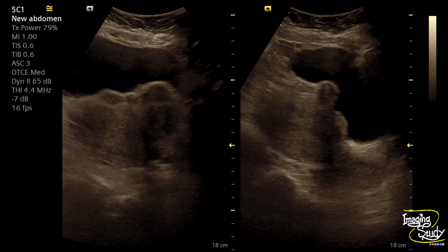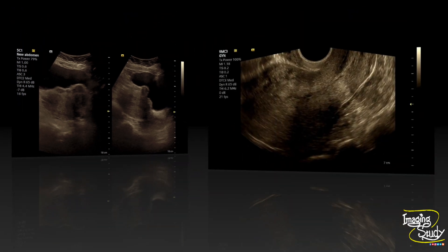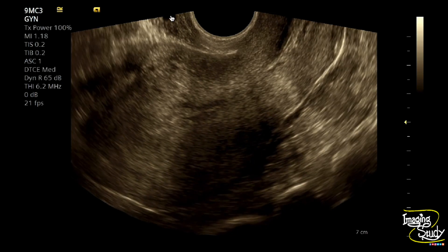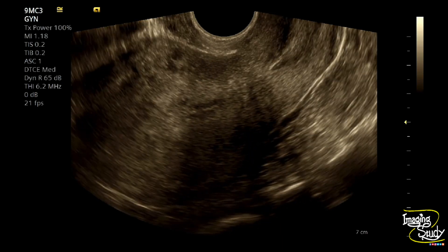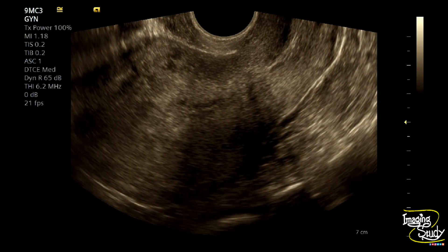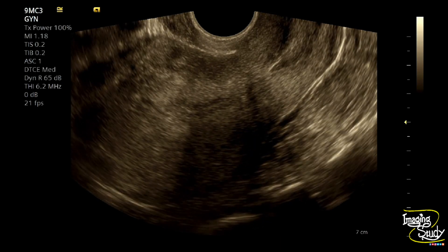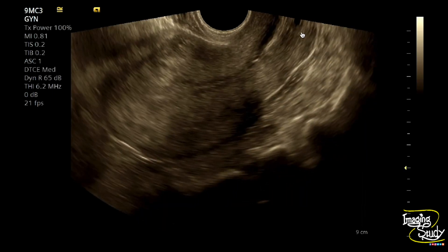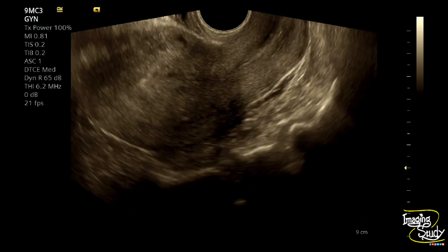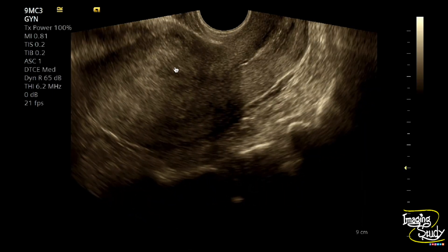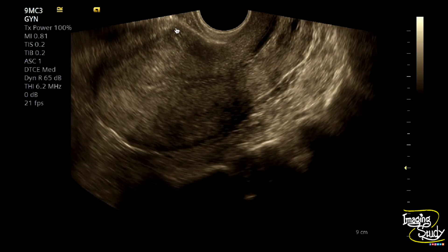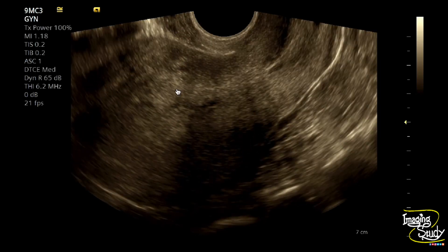Now let's go for the transvaginal ultrasound findings in this patient. Here's the longitudinal section of the uterus — the uterus looks slightly bulky. If you look carefully, there is something within the cervix of this patient, and this part of the anteromyometrium doesn't look homogeneous, so we will evaluate it further.